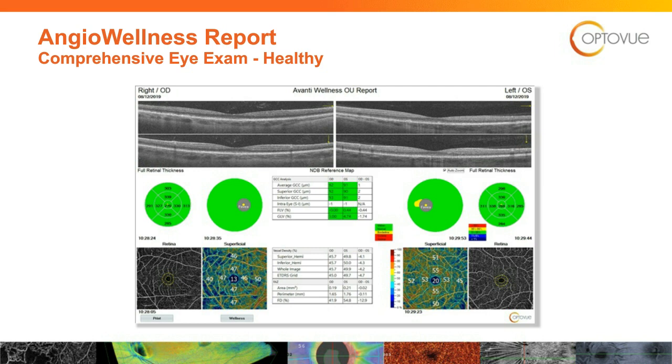That's great. We drop down here to the focal loss volume. That's another test there for glaucoma, a very strong indicator. When it's yellow or red, we need to investigate whether or not it's glaucoma. So I say that scale is right beside it. Green is normal, yellow is abnormal. So green is good, yellow is caution, red is bad. You can see all your numbers are in green, which translates to the 2 little green circles to either side of that box.